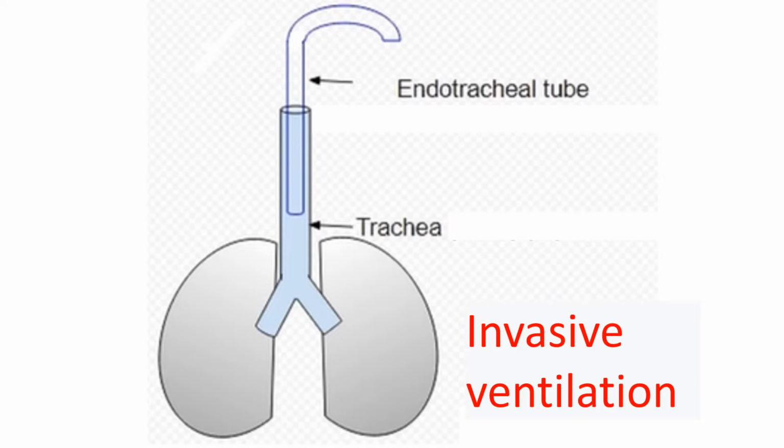An endotracheal tube is introduced under topical anesthesia with sedation or general anesthesia. The endotracheal tube is connected to a mechanical ventilator using appropriate connection tubing. In those who do not tolerate the presence of an endotracheal tube, deep sedation and neuromuscular blockade will have to be given. A few patients do tolerate the endotracheal tube in the awake state without need for much sedation, especially after the initial few hours.